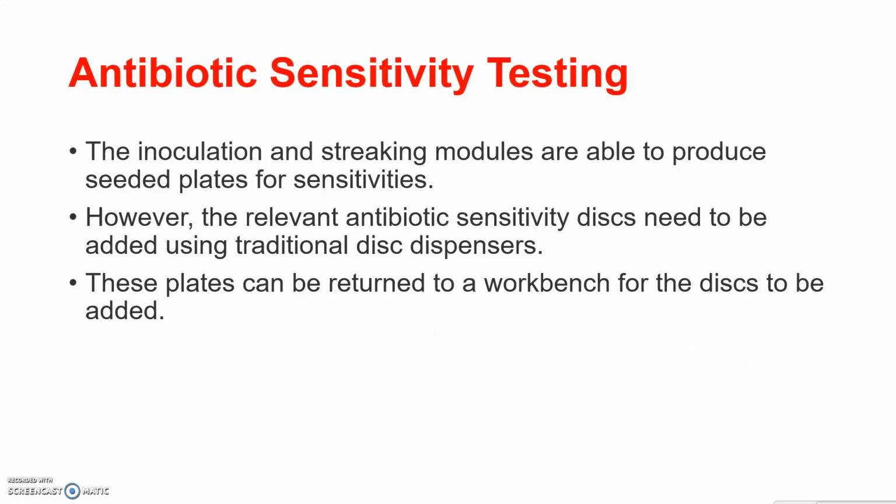Antibiotic sensitivity testing. The inoculation and streaking modules are able to produce seeded plates for sensitivities. However, relevant antibiotic sensitivity discs need to be added using traditional disc dispensers. These plates can be returned to a workbench for the disc to be added.